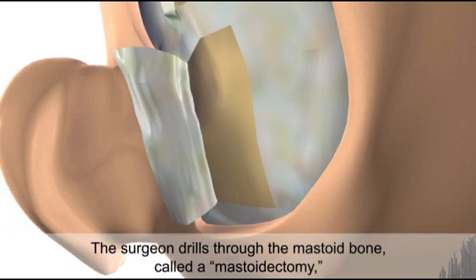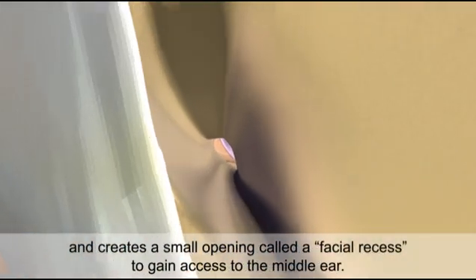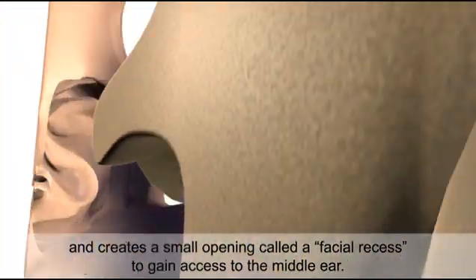The surgeon drills through the mastoid bone, called a mastoidectomy, and creates a small opening called a facial recess to gain access to the middle ear.